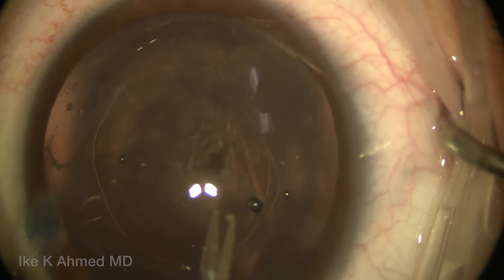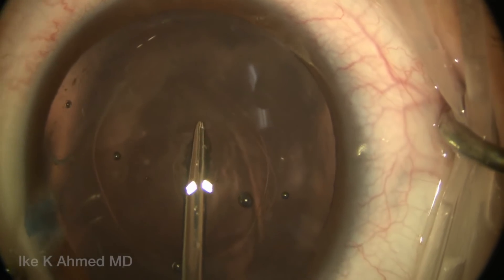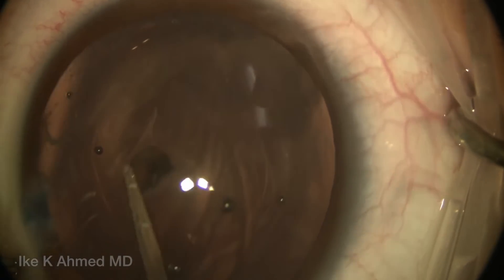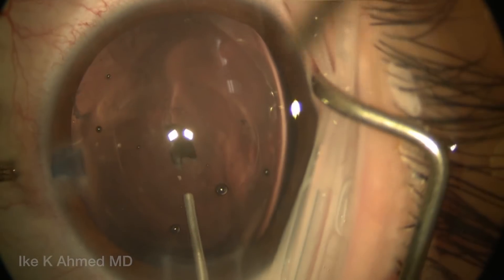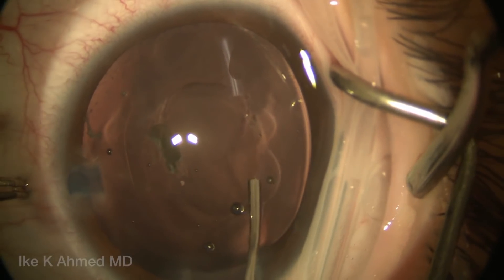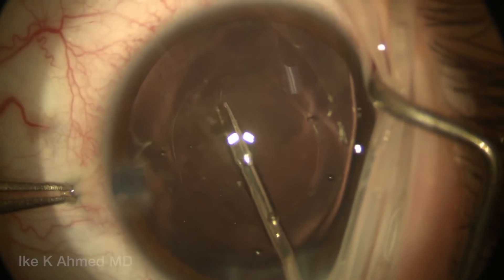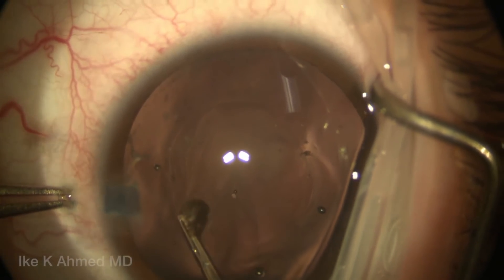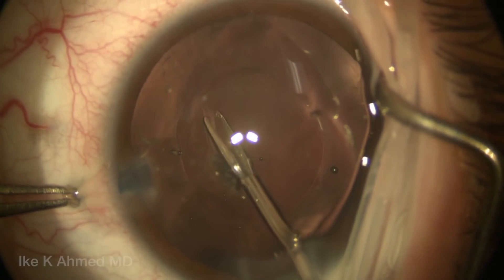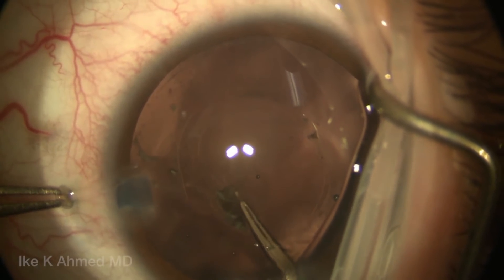Doing a posterior capsule rhexis is not too different than doing an anterior rhexis, although we're working at a steep angle with our instrumentation. There's very little countertraction and less tendency for any tactile feedback. You see here we're injecting some viscoelastic to ensure we keep the chamber formed, and we're using a combination of shearing and stretching techniques to ensure this rhexis is adequately sized.